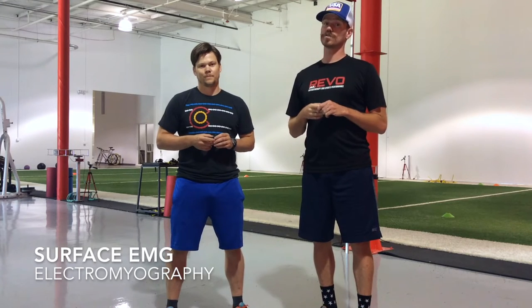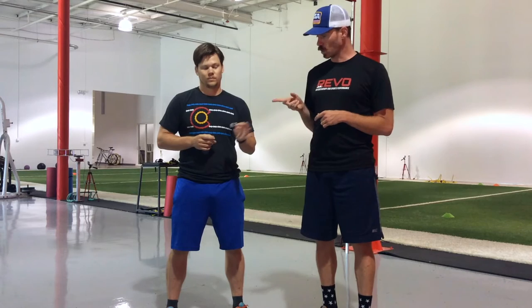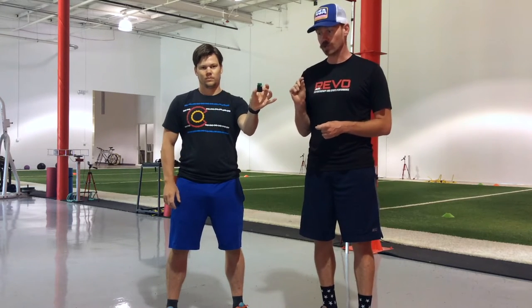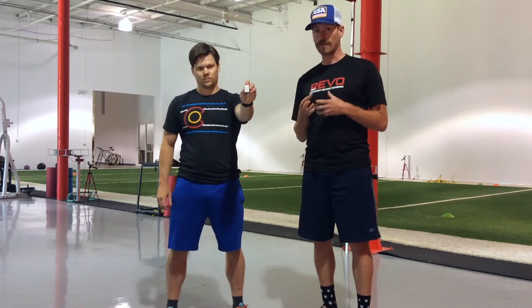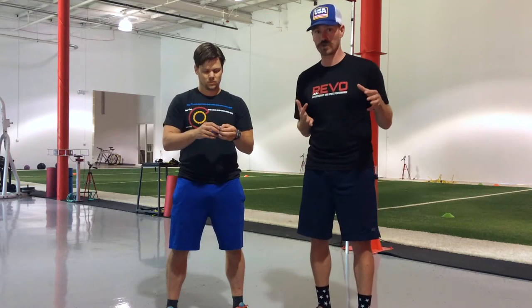Rebo PT back with another video. Today we want to talk about EMG. This is a technology we use in a lot of our assessments and treatments. Brian's holding the unit — it's just like a little tiny, almost looks like the key fob for your car. On the back there are four little metal pieces that when we put that on your skin, this is measuring the electrical activity going through the muscle fibers.